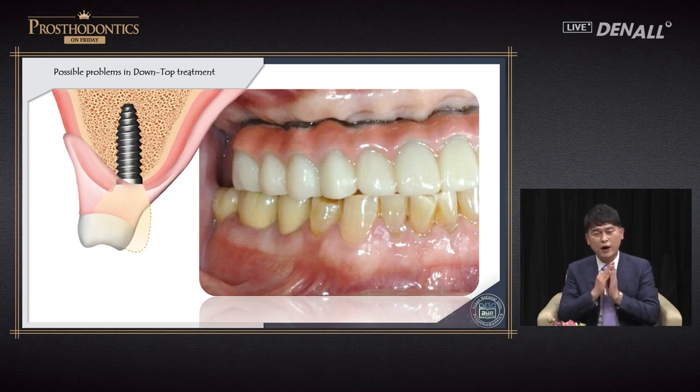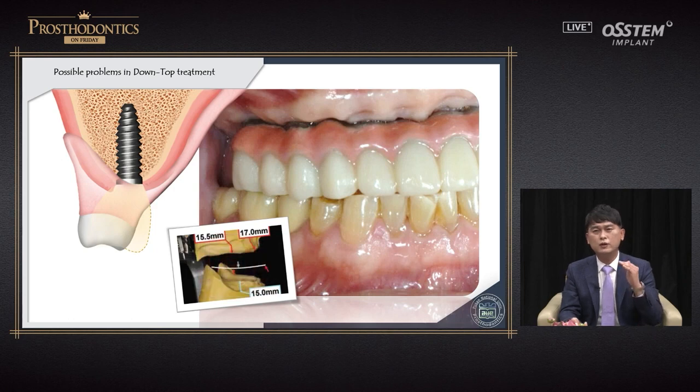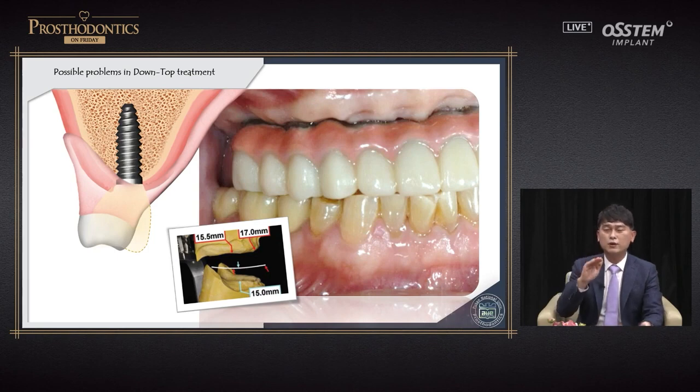I'm not talking about overextension of gingiva like a denture. We can place the denture base a little bit outwardly for a proper emergence profile and artificial tooth. We can position the tooth in the proper position, and it helps cleansing, and a more aesthetically ideal prosthesis can be made. Especially when the vertical defect is quite large, a fixed prosthesis with gingiva is not that good.